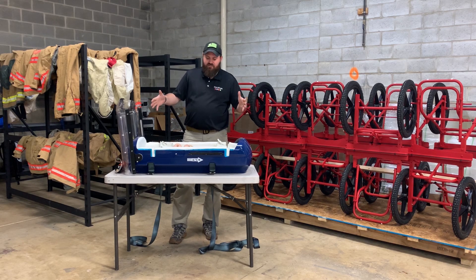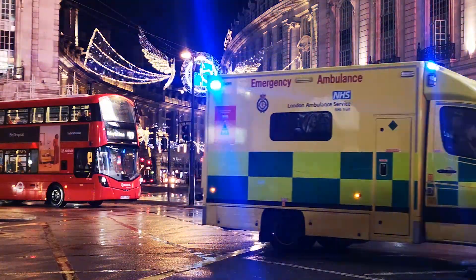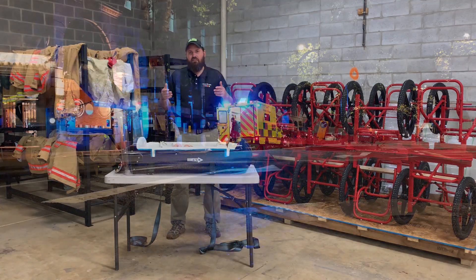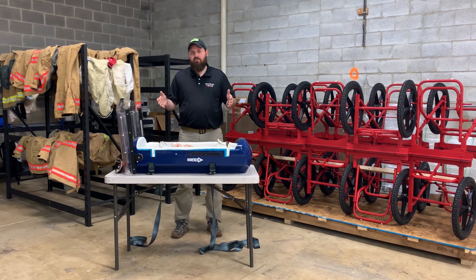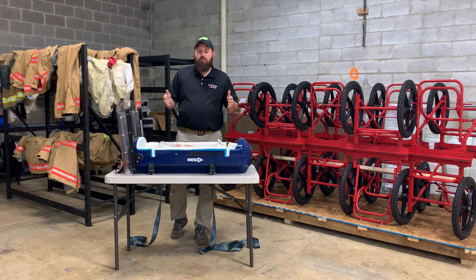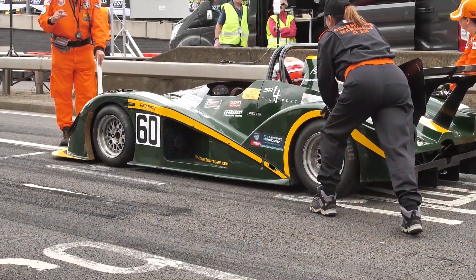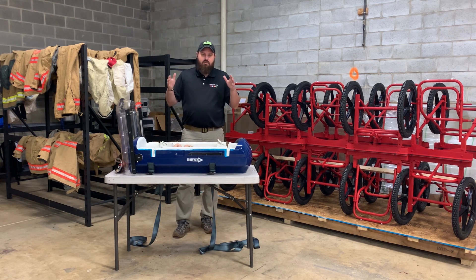The story behind this device is that a group of folks over in England were starting to see problems with infants being transported inside ambulances that were then being involved in crashes. A fairly minor crash could actually turn the very large and very heavy isolette being used to transport infants into a heavy missile inside the back of the ambulance, injuring the patient, caregivers, and even family members. So the folks at Williams Engineering, who designed race cars, decided there had to be a better way, and they took Formula One technology — this monocoque design — scaled it down, and applied it to transporting an infant.